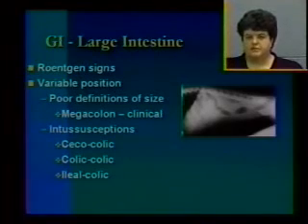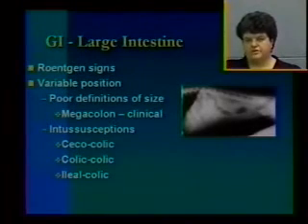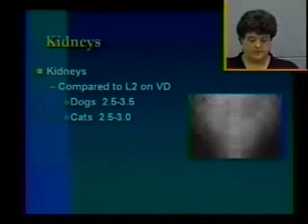Intussusception may be something that shows up on the ultrasound section, because it has a characteristic appearance of a bullseye. So looking at the history and looking at the ultrasound, you may be able to determine that that's what's going on. So I move on to talk about kidneys.